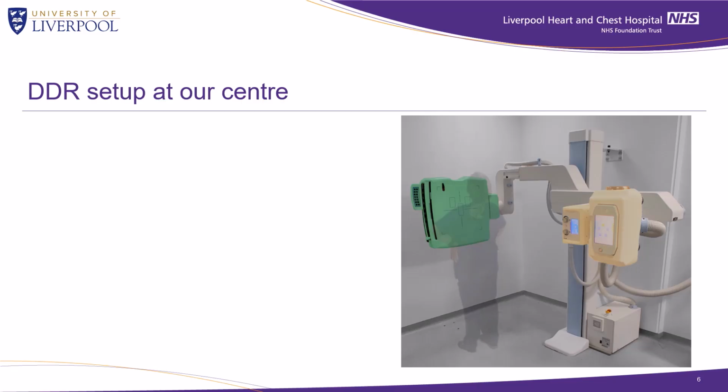We've used DDR predominantly for chest imaging, hence we refer to it as DCR, Dynamic Chest Radiography. This is echoed in a lot of the nomenclature of literature on chest applications of DDR. We have a standalone U-arm system, currently being upgraded to a ceiling mount to allow more versatility in image acquisition.